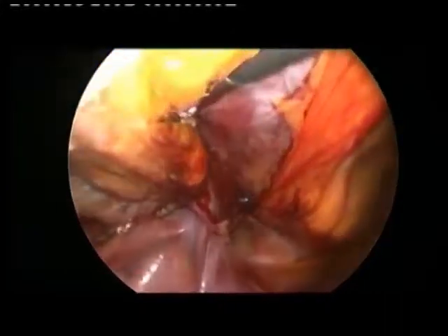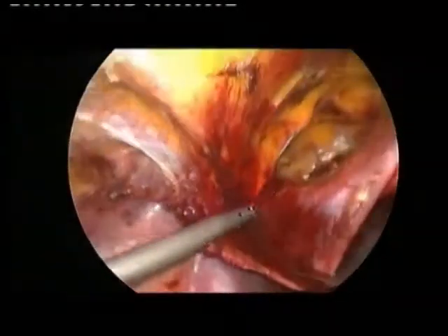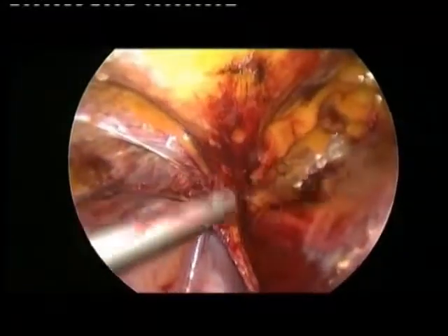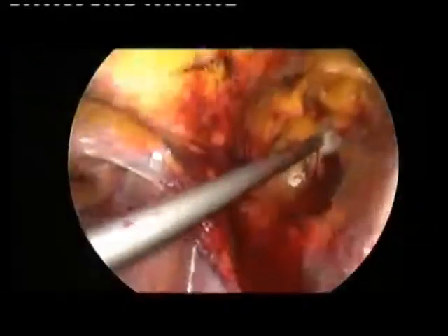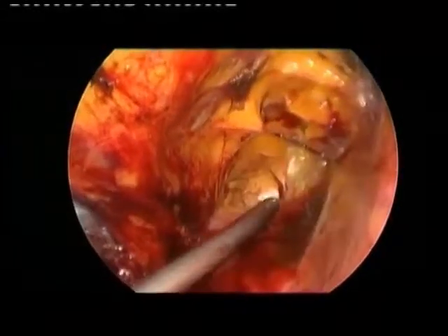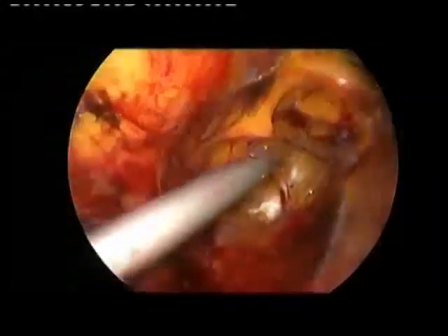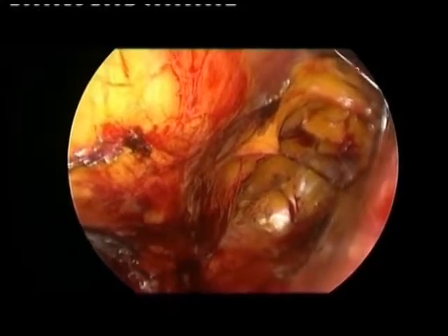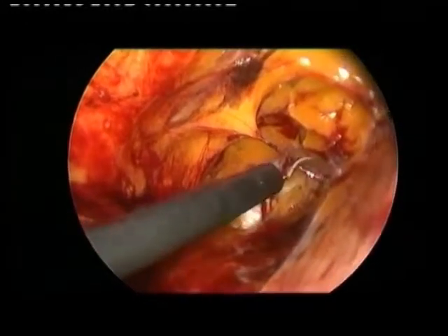With the original stitch. Of course, this can also be done with laparoscopy, but I think that it's better. And now I'm doing the same thing with the other suture.